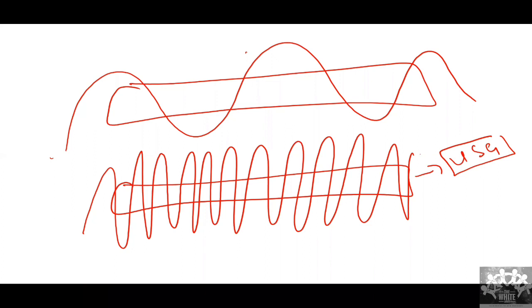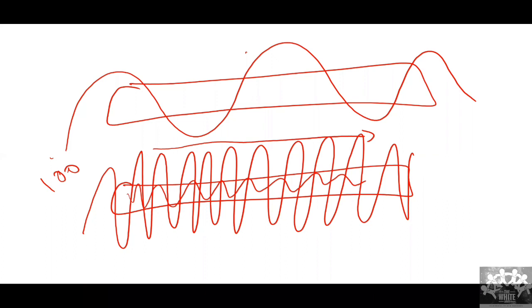What if I have sent 100 decibels? Some amount will be dissipated here as heat. As it goes deeper, there will be loss of this 100 decibels, and when I reach here, it might be only 10 decibels left. Now imagine if I have sent the same 100 decibels with a lower frequency, then it is not involving the tissue so often as the higher frequency. So the amount of decibels lost might be less, and we might have around 80 decibels here. So we can get reflection of sound.